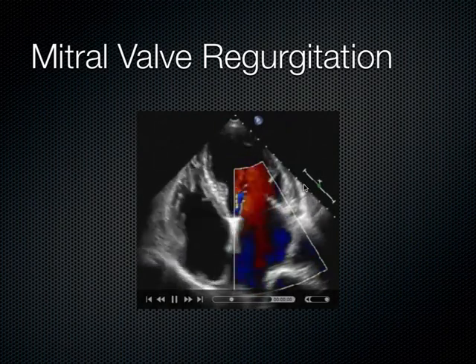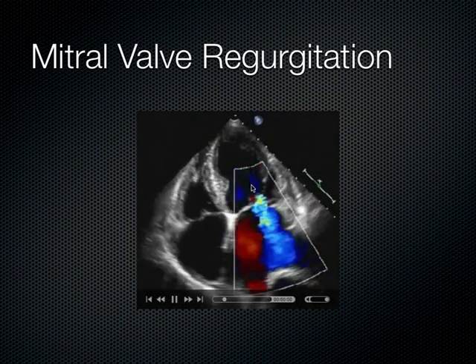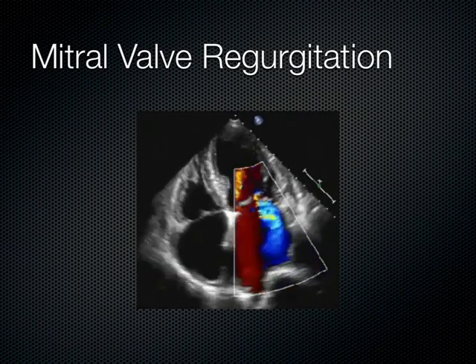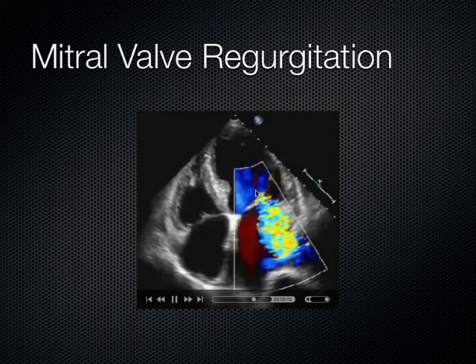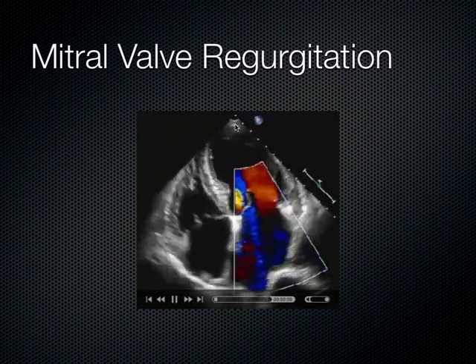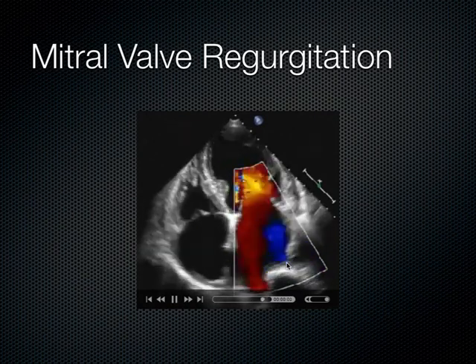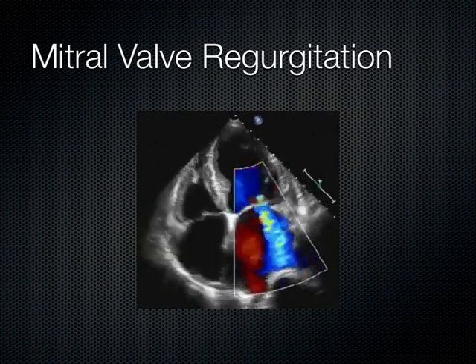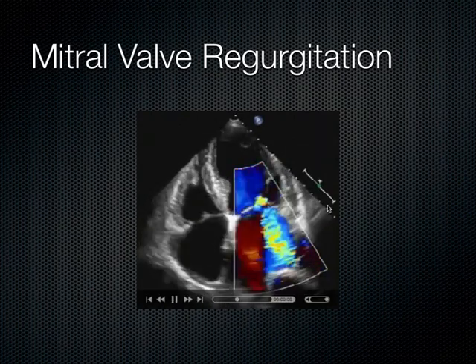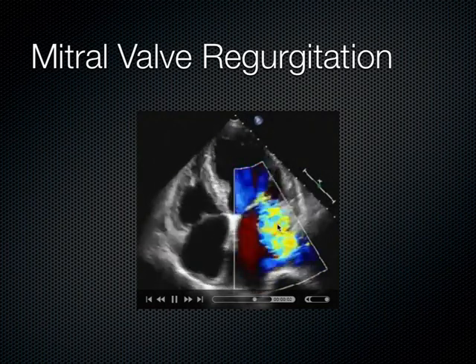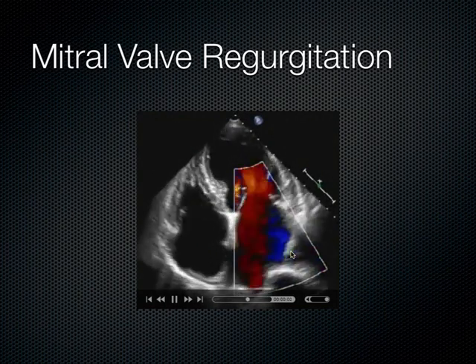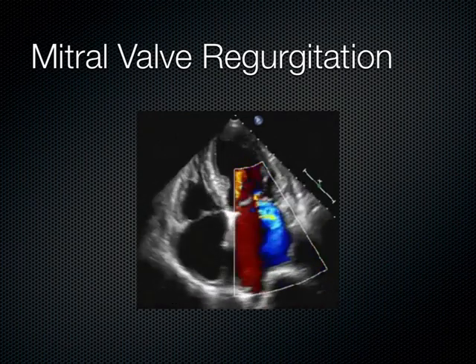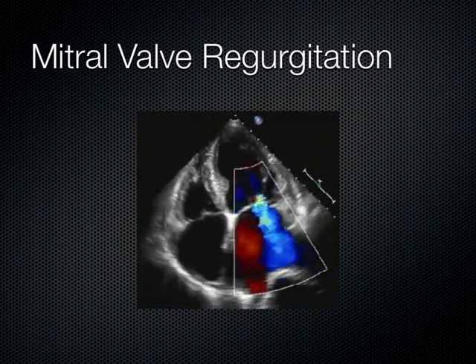To look at the mitral valve, the apical 4 chamber view is best, where we can see BART — B-A-R-T — blue away, red towards. During systole, there is a blue jet that moves away from the probe's footprint and into the left atrium. Each time the left ventricle squeezes, as we put color flow Doppler over the mitral valve, we can see a blue jet squirting back into the left atrium. This blue jet hitting the back wall of the left atrium means the patient has mitral valve regurgitation.